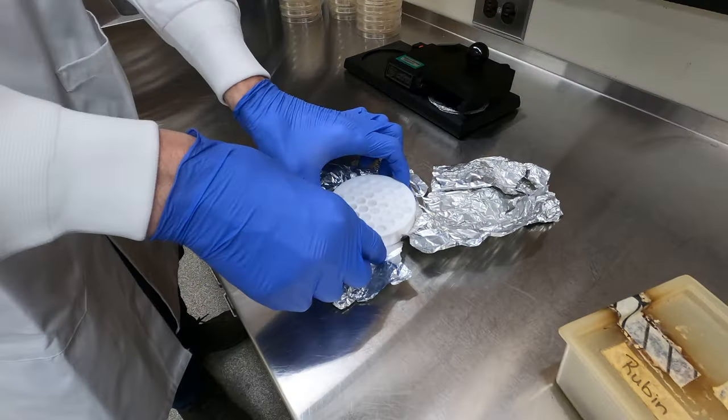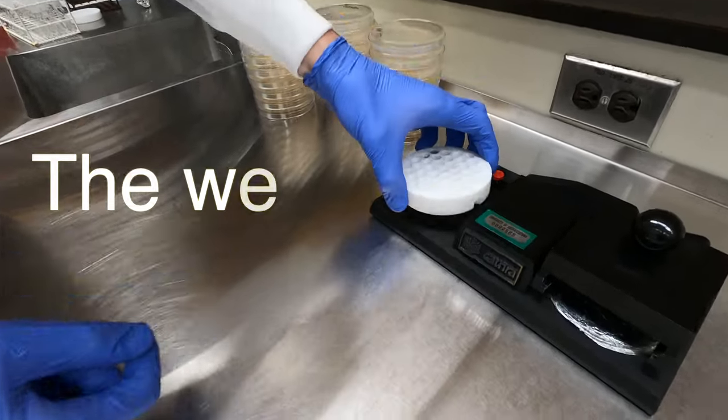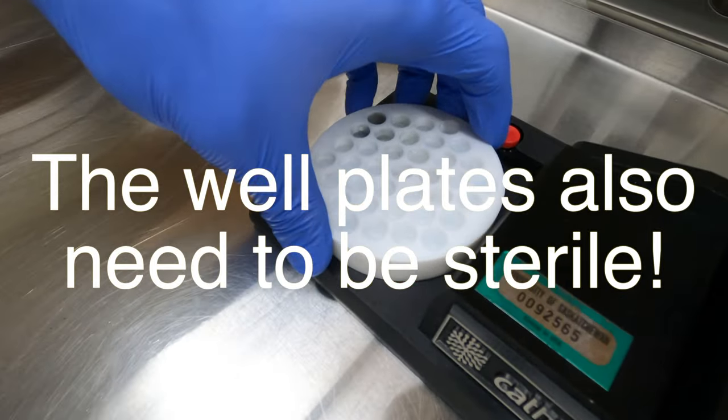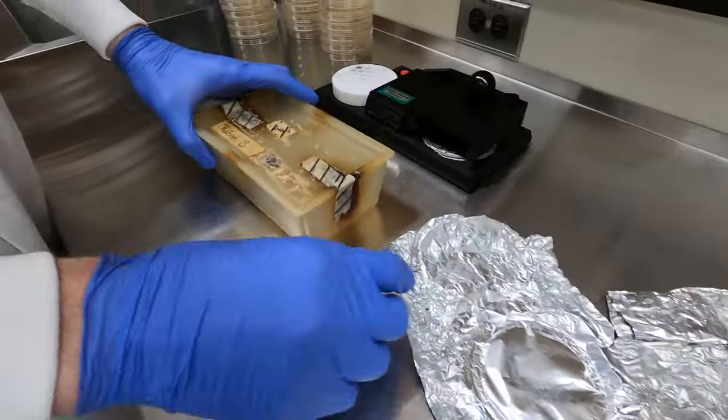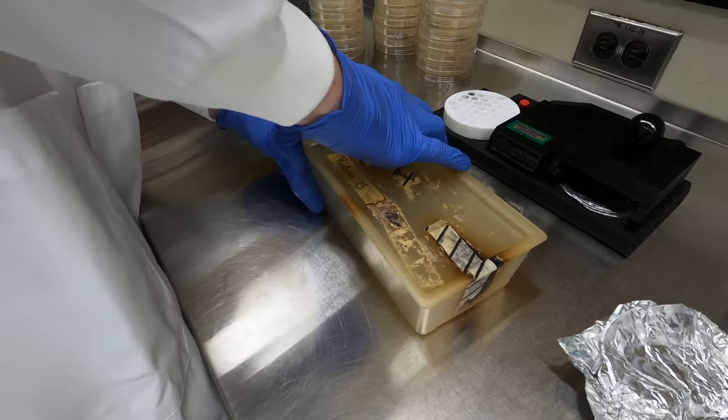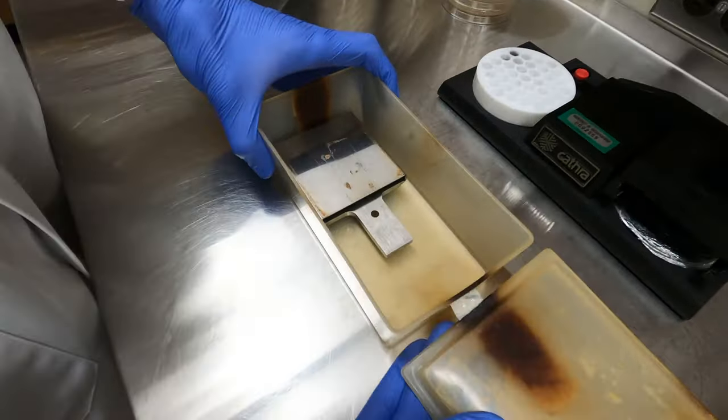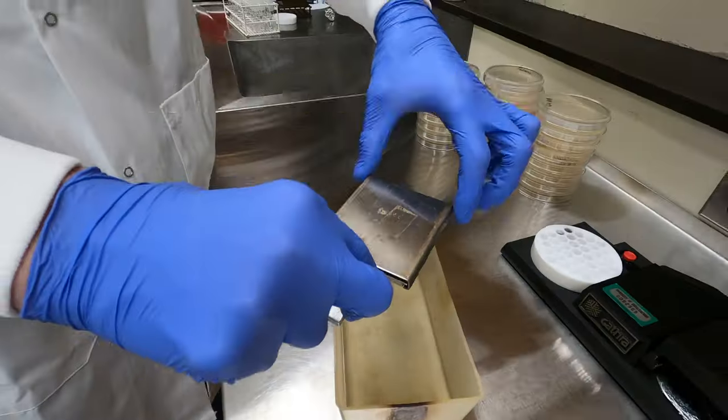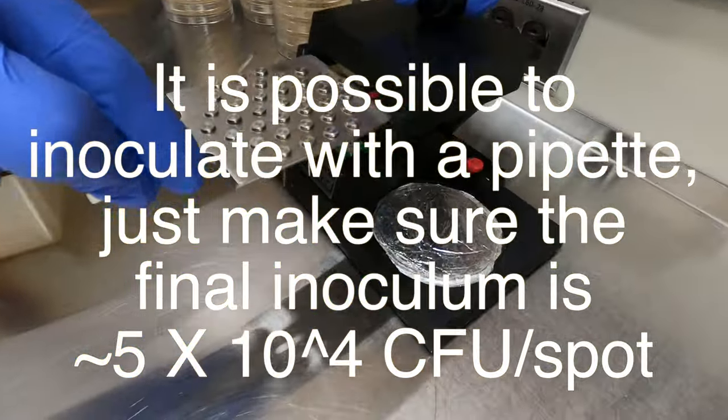We transfer our well plate to the replicator device, and we're now ready for our autoclaved stainless steel pin plate. These stainless steel pins are calibrated such that they deliver exactly 0.1 microliters of our McFarlane 0.5 suspension, giving us a final inoculum of 5 times 10 to the 4 colony forming units per spot, which is in accordance with the CLSI guidelines.